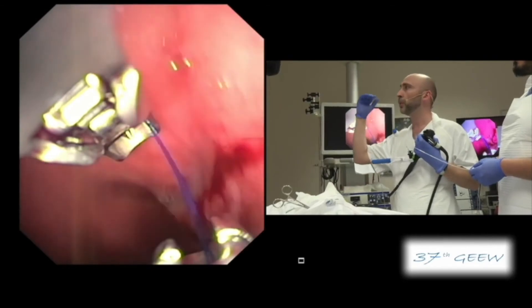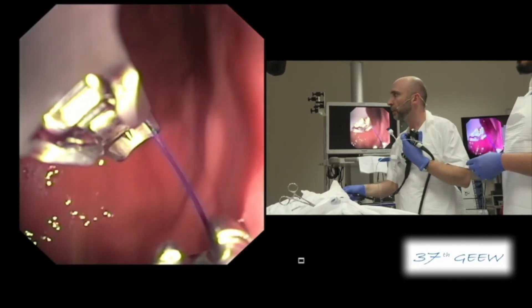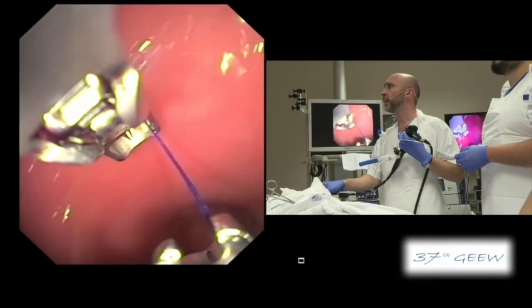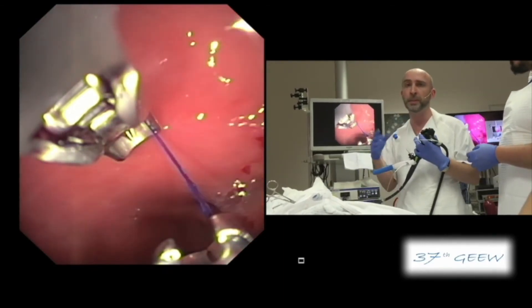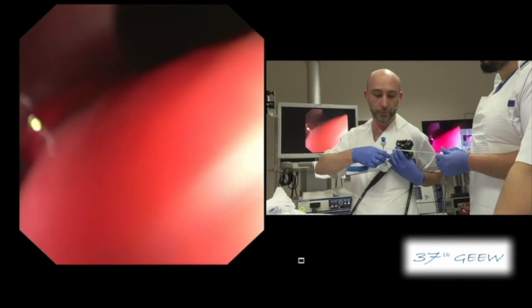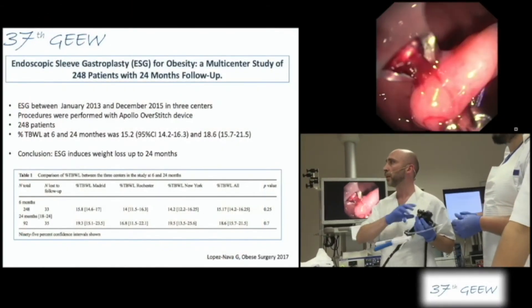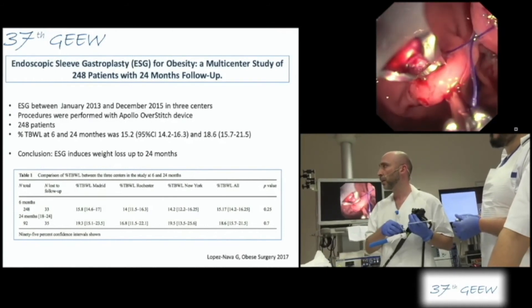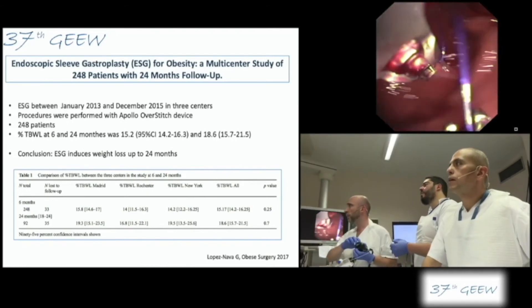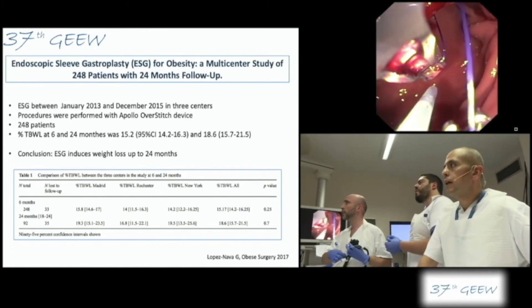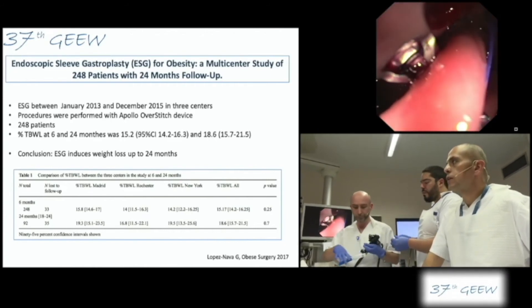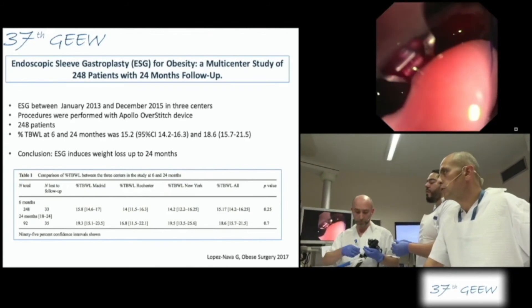The shape that we will do is starting from here and ending up here, and not going up on the posterior wall at this height, because in case of perforations or any problems it is easier for the surgeons to go there and repair it. Ivo or Mustapha, can you comment on the result about weight reduction we know with this kind of technique? Just in the last DDW had showed her five years follow up of the patients where she showed also 18 percent of total body weight loss after three years and 45 to 50 percent of excess weight loss. This was the longest follow up we have.